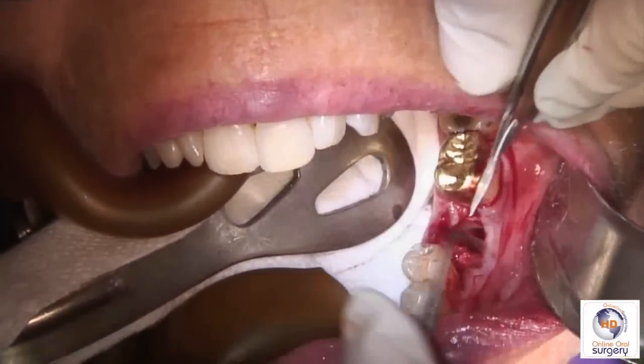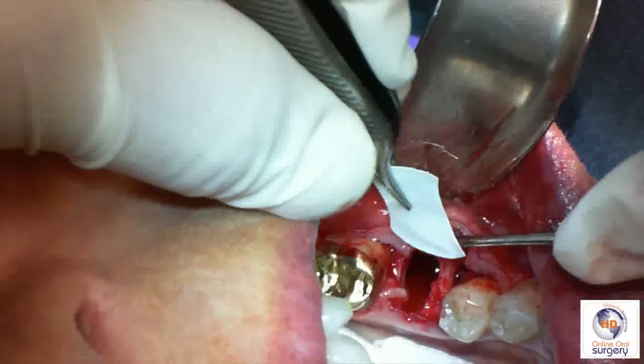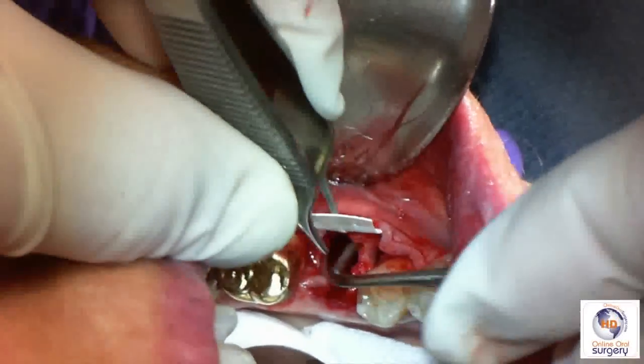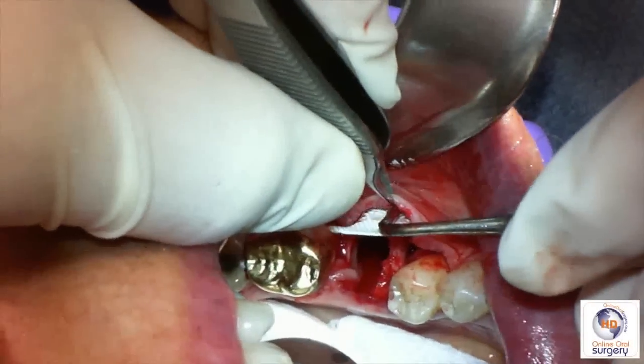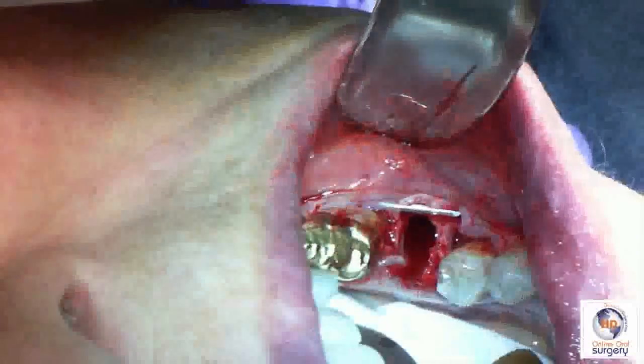We're going to carry the membrane gently into our extraction site. We've elevated and undermined our flap on the buccal, so we're going to slide it into that pocket first. And as you can see, it is properly trimmed to fit interproximally. The other end is going to be tucked in on the lingual.